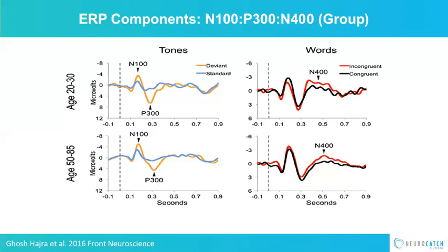So it takes only 100 milliseconds on average for most people to process a tone. Some people will process them faster. Sometimes they will be later. I'll show you later on that if you have a hearing impairment, you would expect the timing for this to change.